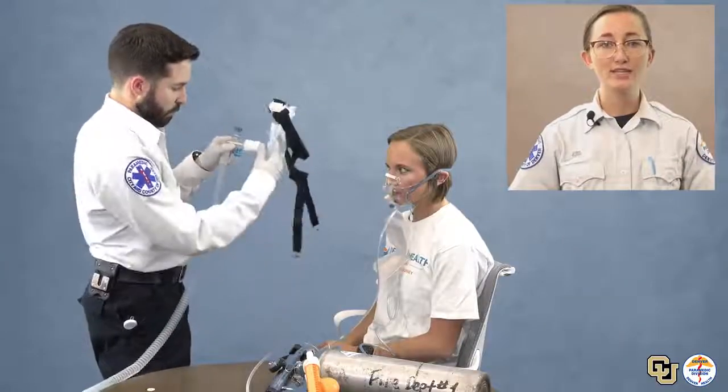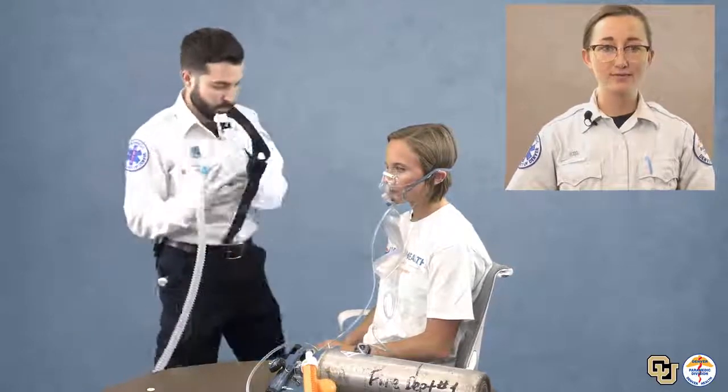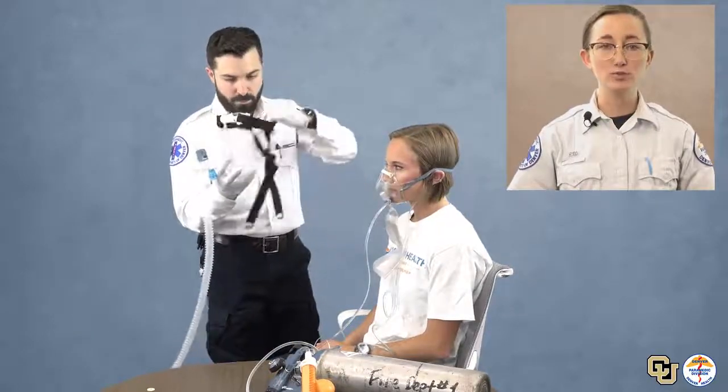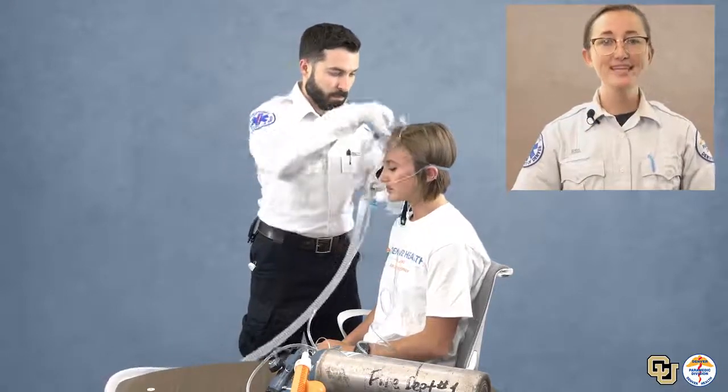Now we are going to attach the other end directly to the mask. We will feel air coming out of the mask. The next step is best accomplished with two providers. Let's remove the non-rebreather face mask. The end-tidal capnography cannula can be left in place.